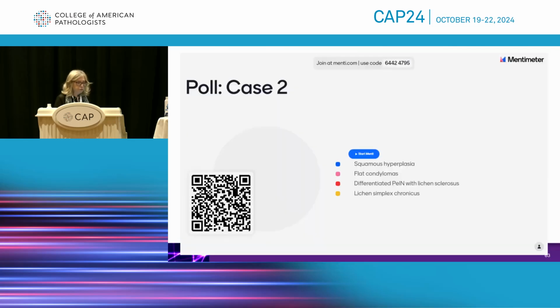Okay, so I want you to give me your differential diagnosis now. Okay, I'm going to start the poll.